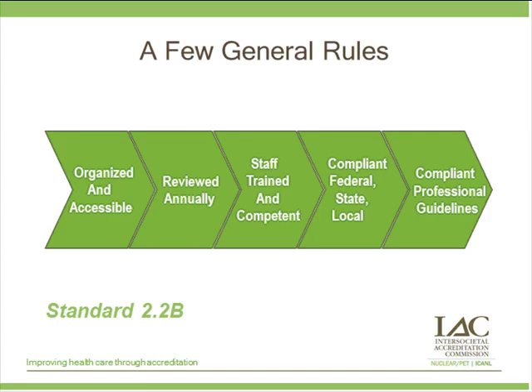Keep these general rules in mind regarding protocols. Procedure manuals must be compiled into one notebook or area, and they must be organized for easy use, having a table of contents. Applicable sections or headings for the table of contents could include clinical imaging protocols, exercise and/or pharmacologic stress protocols, therapy protocols, equipment quality control, radiation safety and radioactive materials handling, administrative policies, and lab quality assessment or improvement. Availability of protocols in digital format is desirable.